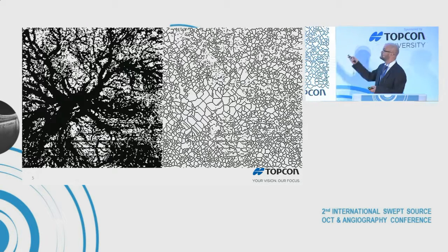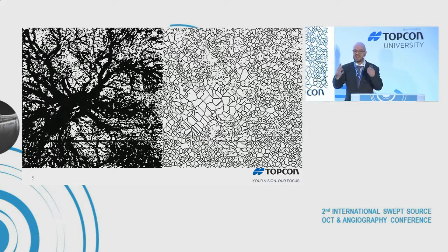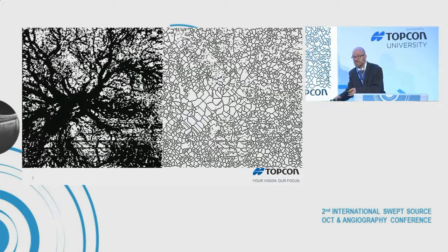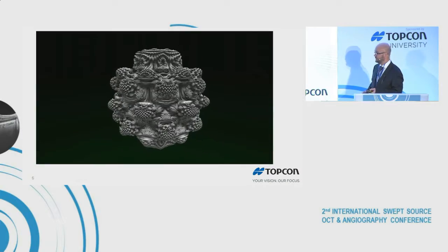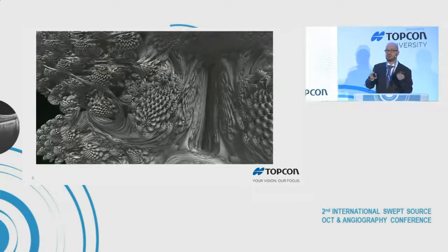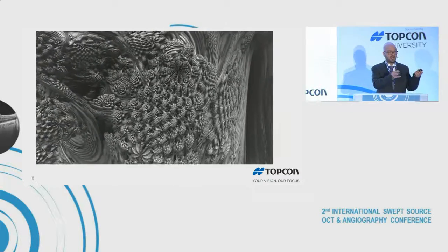So in order to visualize this correctly, and in order to understand it correctly, we need to segment it three-dimensionally, analyze it three-dimensionally, and then we can have a much better understanding of the activity indexes of these diseases. So how do we do this? Let's go back to this one case we had. How do we do this? We do it with something called three-dimensional fractal dimension analysis.